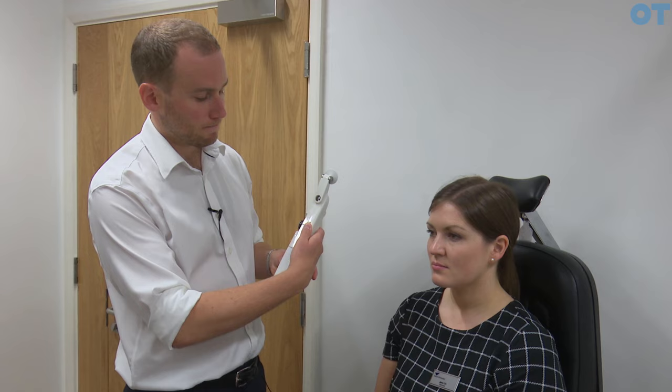We're now going to stand to the side of the patient and ask the patient to look towards a spotlight or a similar target that they can see. If the patient is an ametrope and they've taken their spectacles off, it may be important to use a target that is clear for them to see. Before we begin the technique we want to place the probe on and set it at a rough average pressure — today we're going to use 15 millimetres of mercury.